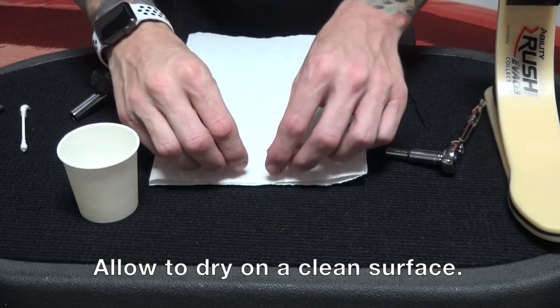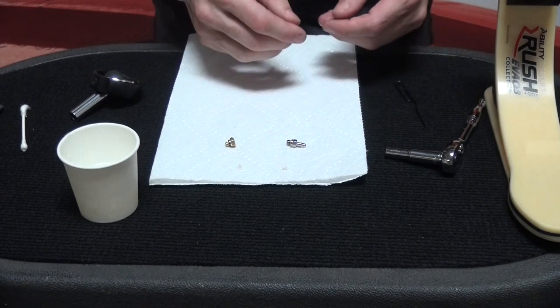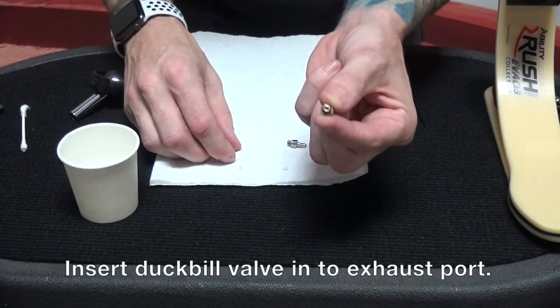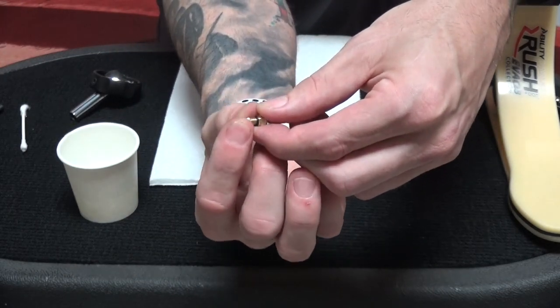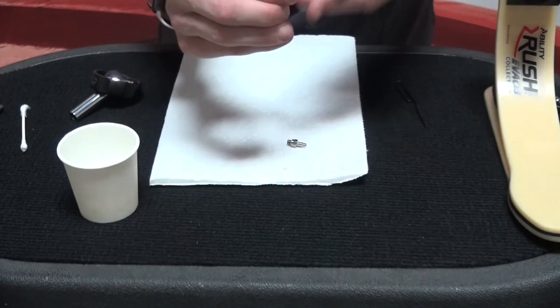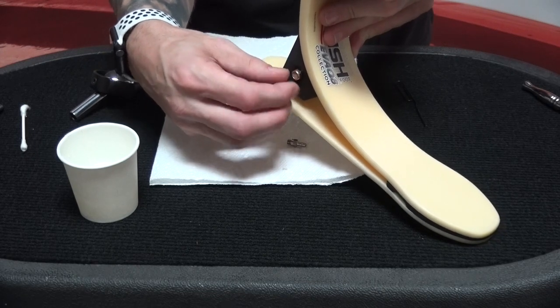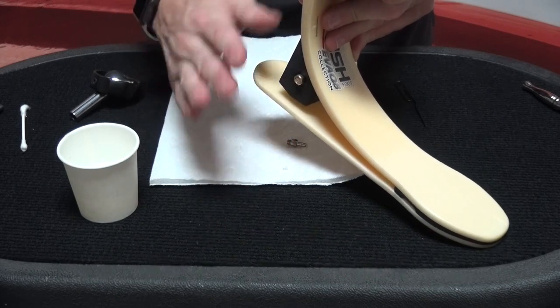Now I'm going to leave everything sit here to dry. So we've completed cleaning everything that we need to and we can now reassemble everything. I'll again start with the exhaust port side by taking the exhaust port and placing the duckbill valve right inside there. You'll see that it sits just right. Now I'm going to thread that back into the lateral side of the heel and just snug it.